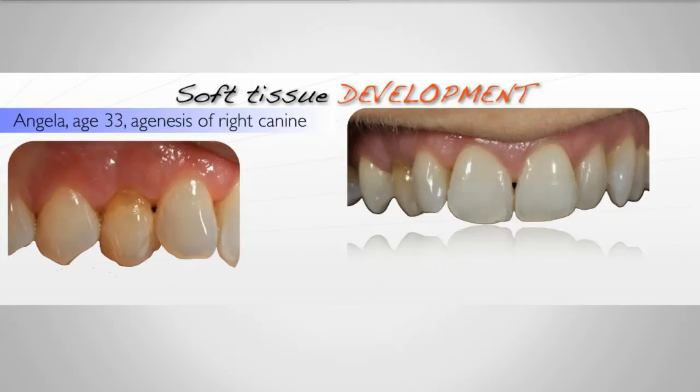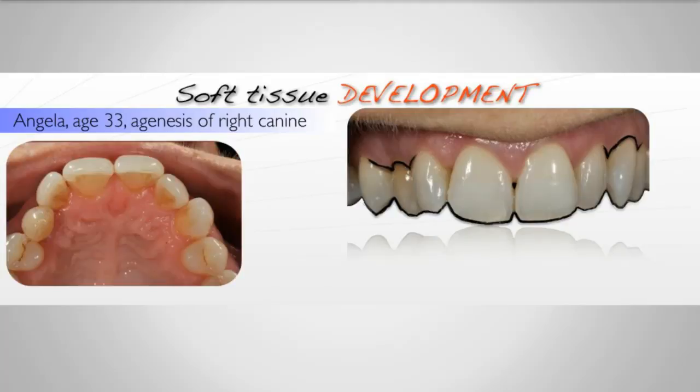All right, so if you look, that one canine, even though it's a single tooth, it's critical aesthetic because it's done two things. It's created an imbalance in the soft tissue levels. And you compare that to the other side. And it's also caused an incisal imbalance. When you look at it from the occlusal aspect, you can see the position of that deciduous tooth. And it's also a little more narrow than the position of this tooth here. She's obviously not in a canine-guided type of occlusion. We're going to keep her in a group function.